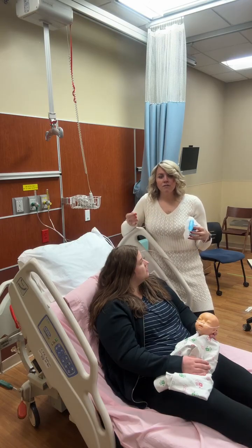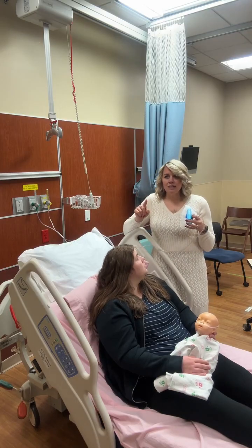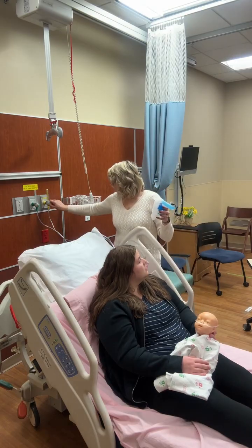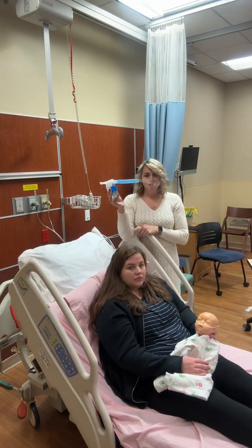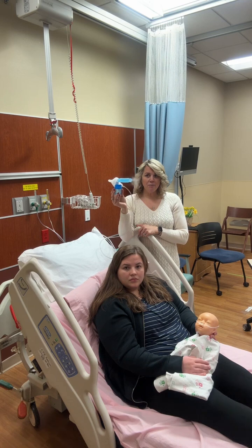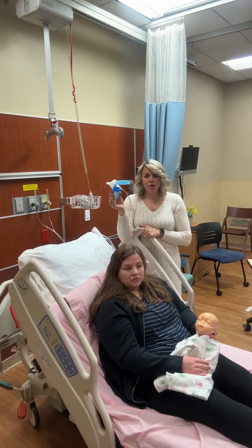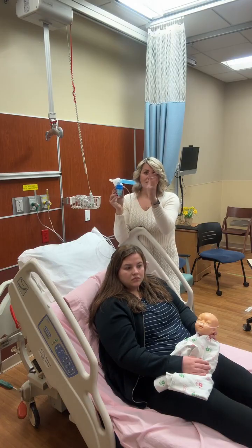And in a situation of a child, like 1, 2, 3, I'm going to turn this on so that you can see what a child may think when they see this. So I've connected it to air on 8 is great, and right now we see that mist coming out. Now, if Ashley's baby was a little bit older, she might be looking at this and saying, hot, ow, owie. They might think that this is heat because it looks like smoke.